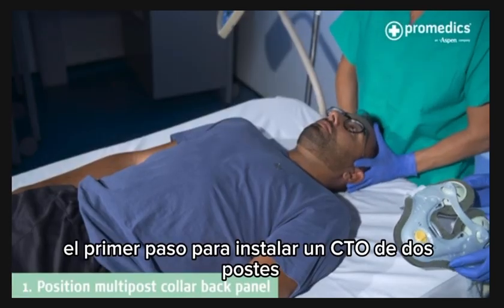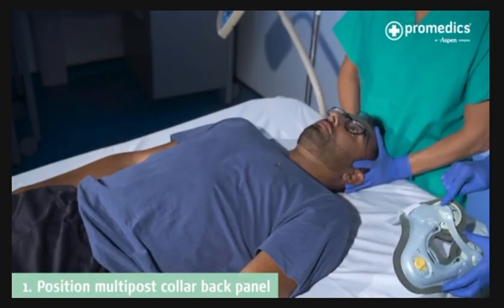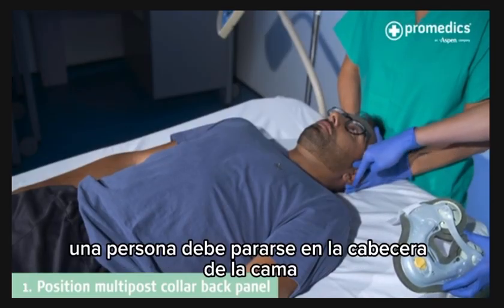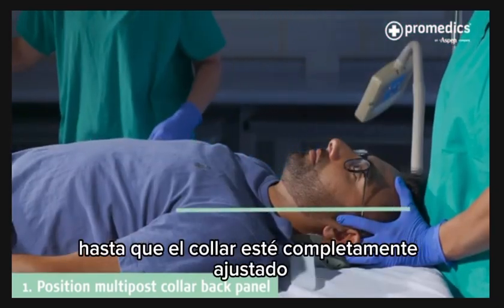The first step in fitting a 2-post CTO is to position the multi-post back panel. One person is to stand at the head end of the bed, performing a head hold to maintain a neutral alignment of the cervical spine until the collar has been fully fitted.